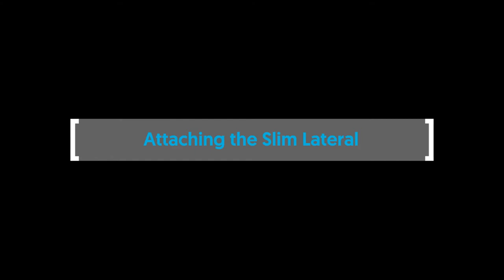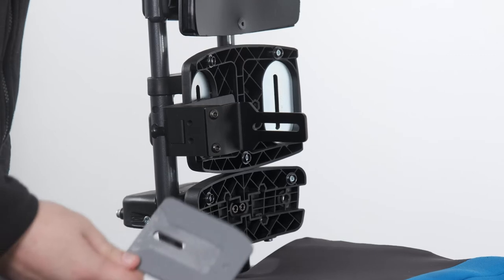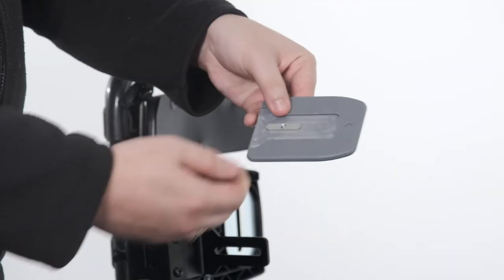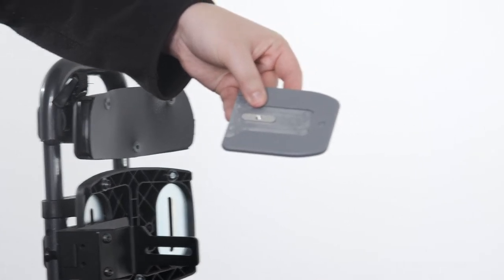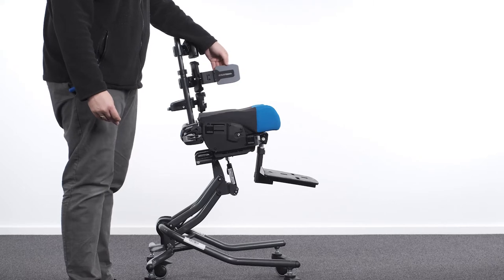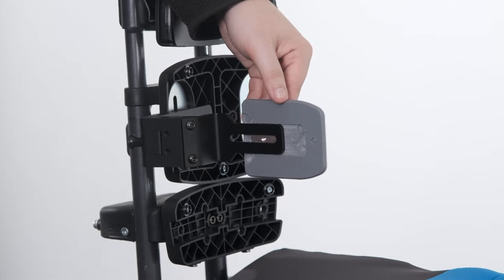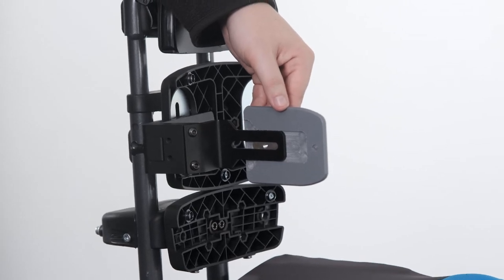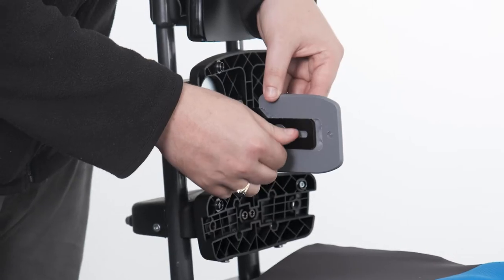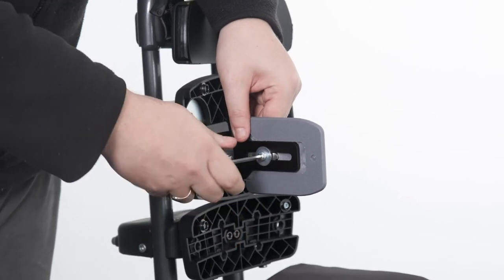Attaching the slim lateral. To attach the slim lateral to the lateral bracket, first place the machine boss into the corresponding slot in the slim lateral plastic pad. Position this assembly against the inside surface of the lateral bracket so that the bracket locates into the recess of the plastic pad and the machined part locates in the slot of the lateral bracket. Place the plane washer onto the bolt and pass it through the threaded hole in the machined part and secure in place with the Allen key.